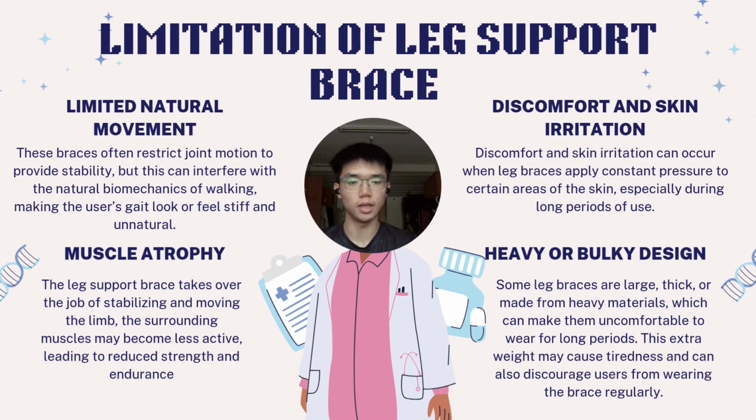Last but not least is heavy or bulky design. Some leg braces are large, thick, or made from heavy materials, which can make them uncomfortable to wear for long periods. This extra weight may cause tiredness and can also discourage users from wearing the brace regularly.